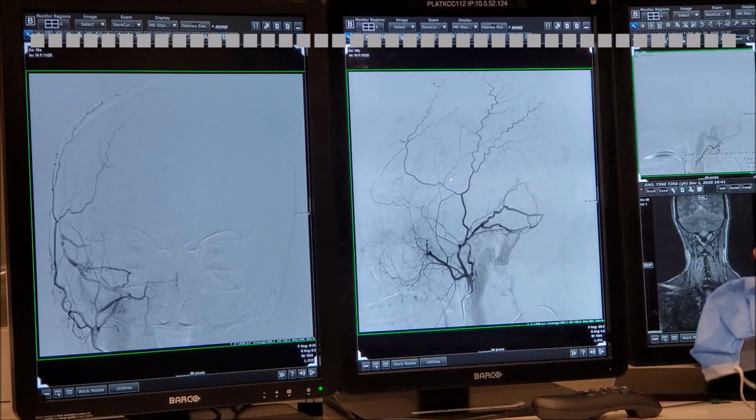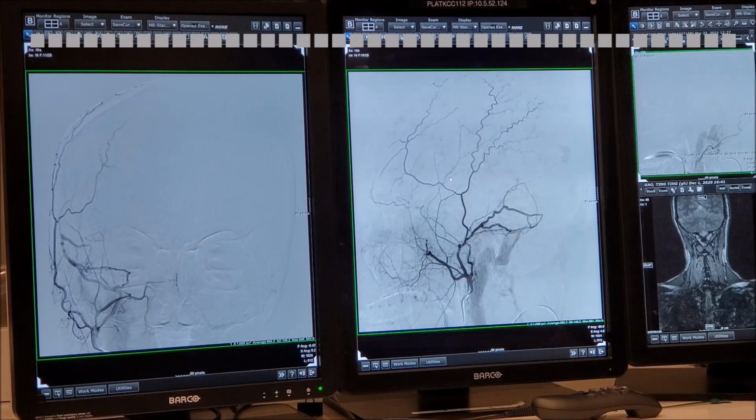You're going to treat it? First, we have to have judgment. Not only you got a hammer, not everything is a nail. This lady is in her 40s, has a dural fistula, no question about it, but has a benign dural fistula. So the question is, number one, should she be treated or not? Then we go as to what type of treatment we can do, right? Yeah, that's right. Okay, so what would you do?